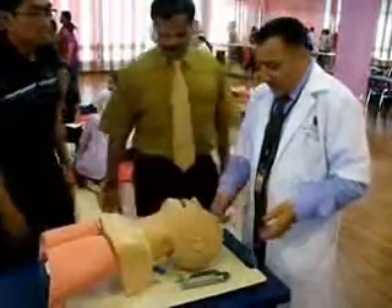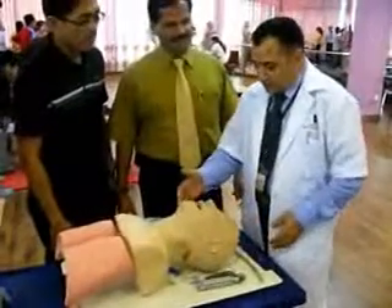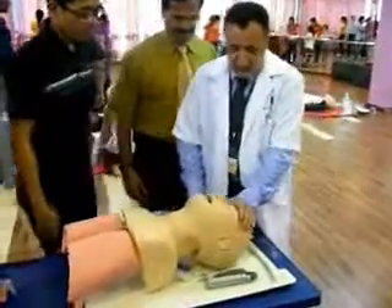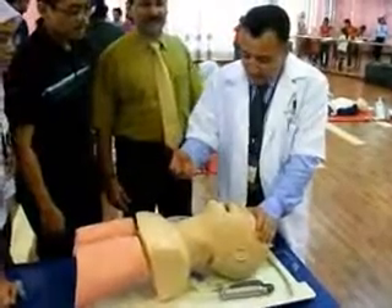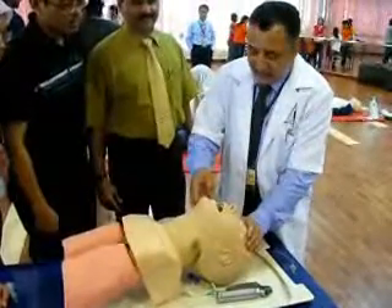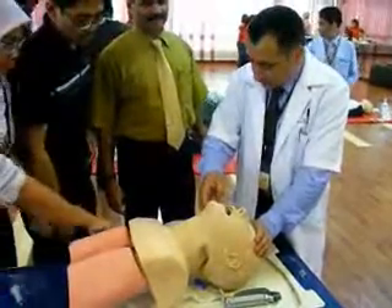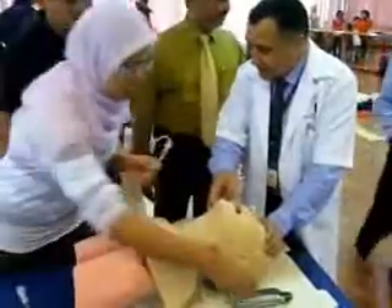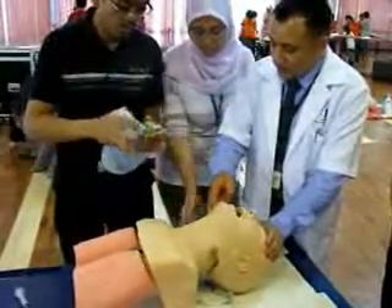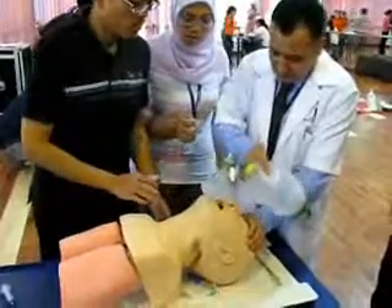While doing endotracheal intubation, you have to put the patient in the head tilt and chin lift maneuver. One of you can prepare the endotracheal tube, and the other can prepare the ambu bag. You can give the ambu bag to me before endotracheal intubation.